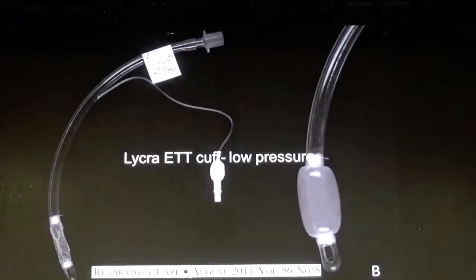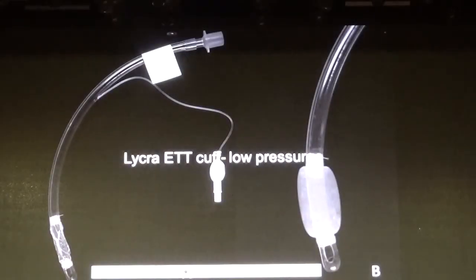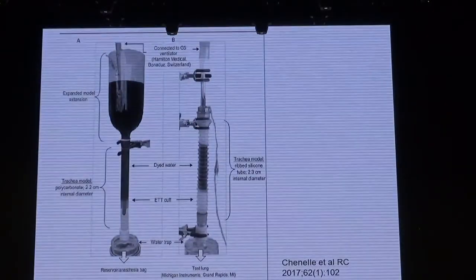The second cuff is a Lycra. Lycra is a material, really a polyurethane, but very thin, and it's about 200 times more elastic than the polyurethane. So by inflation, it can actually apply to the tracheal wall, and it allows maintenance of pressure and therefore no formation of folds around the cuff. And this is the only one that is commercially available.